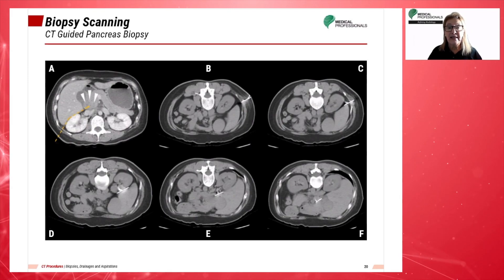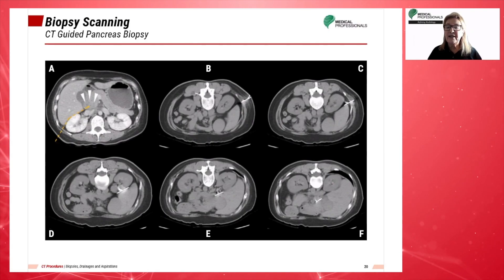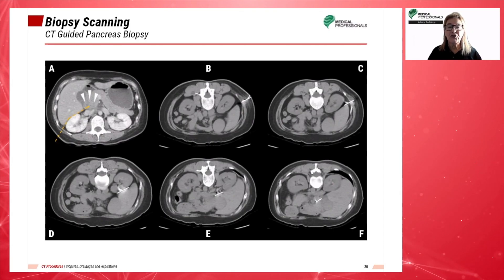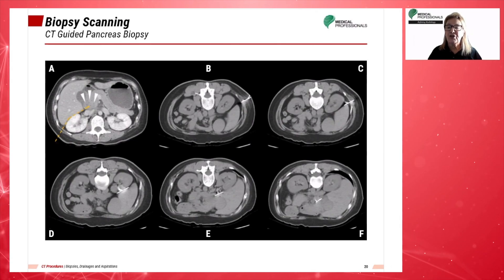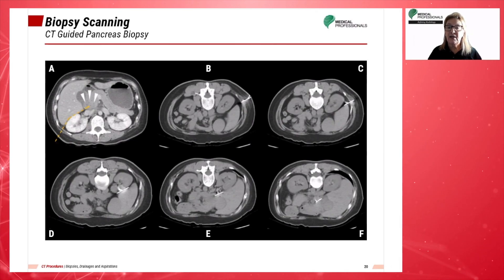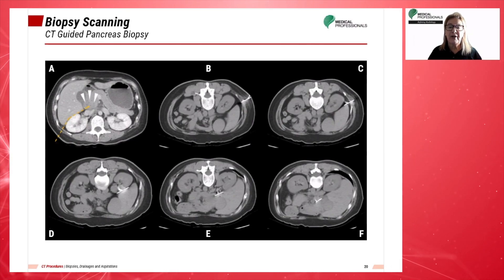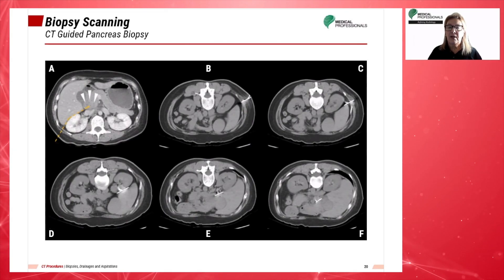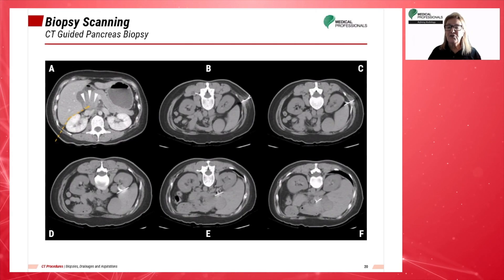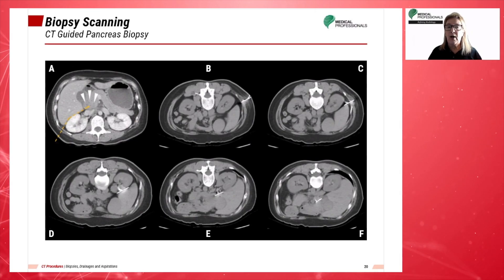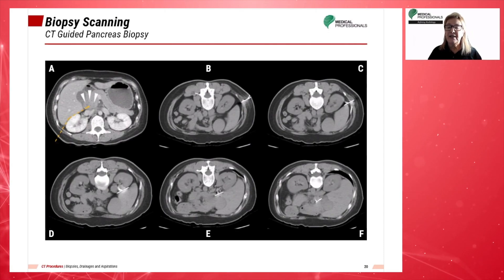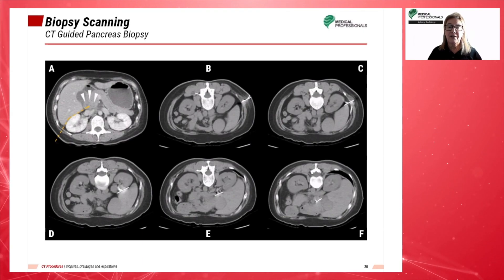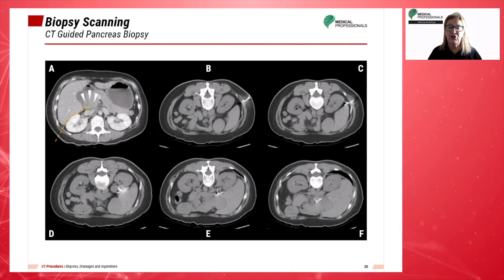In images D and E, when the needle reaches the planned turning point, the needle direction shifts slightly to avoid penetrating the liver. After successful insertion of the coaxial needle into the lesion, as seen in image F, the biopsy gun was fired into the pancreatic head tumor.